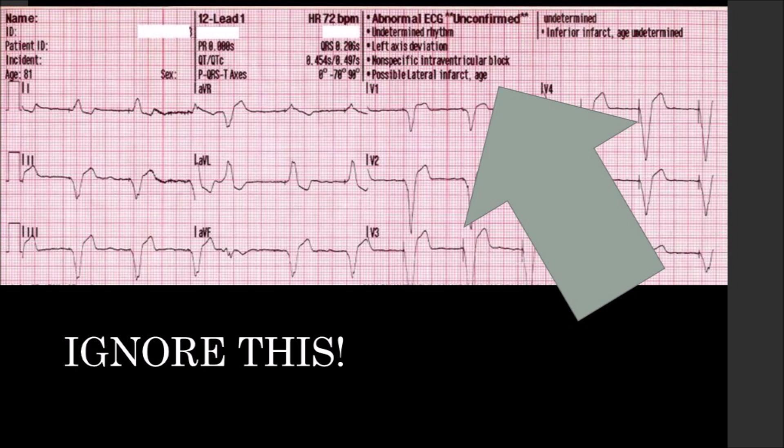Then let's look at the rate: 72 beats per minute. Did we palpate 72 beats per minute? We'll assume in this patient we did. Then we want to look at the QRS width as dictated up here — it's 0.20. So it's wider than 0.12, meaning this is what we would define as a wide complex rhythm. It's wide in V1, it's wide everywhere. Then we move down to the QRS axis.